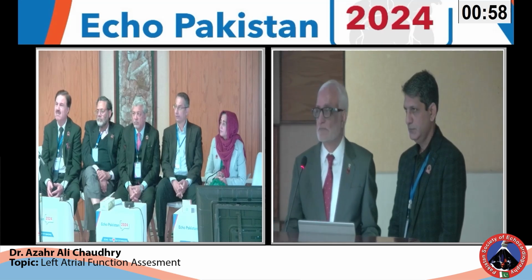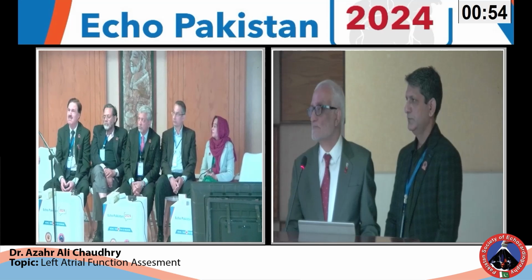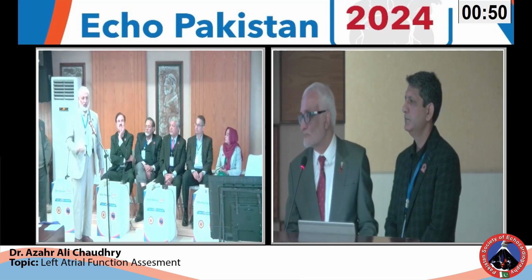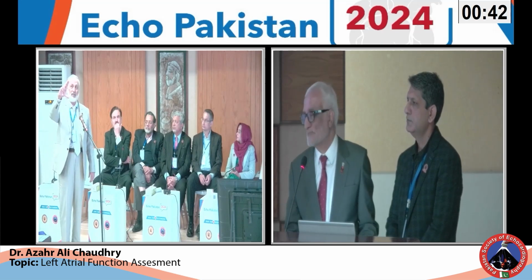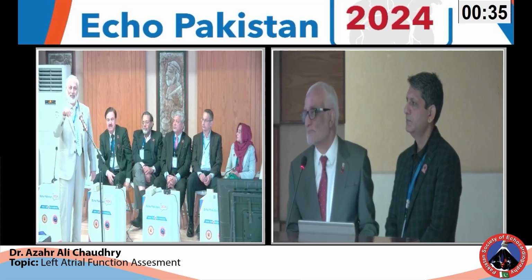It's just a change in the length. Now you can do better if you do just LV volume and length measurements. That software also gives you straight values. You check on your machines, because it's just the change in the length that it is giving. It cannot give you regional values, but it can tell you this was the length of the LV in diastole, and this is the length in systole. That's what we need for strain, right? But this is a crude method, I should say.